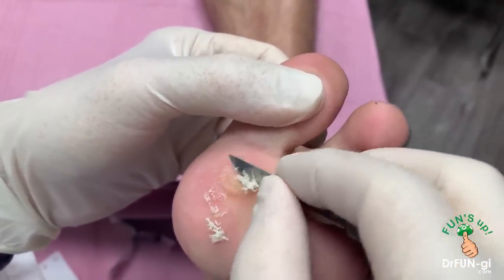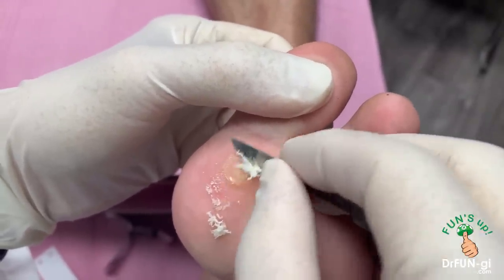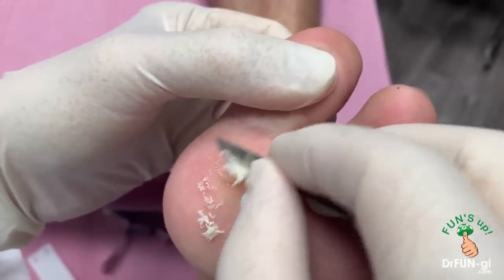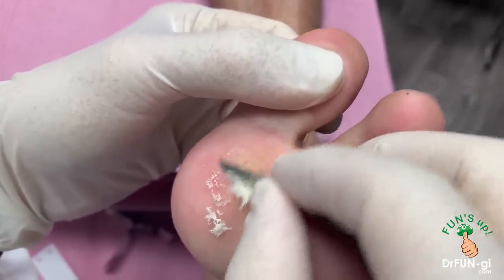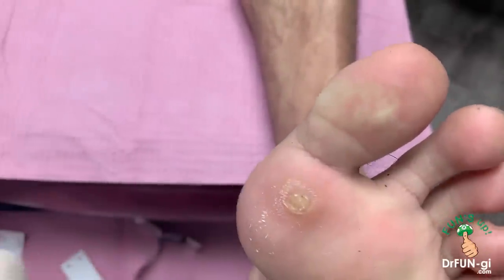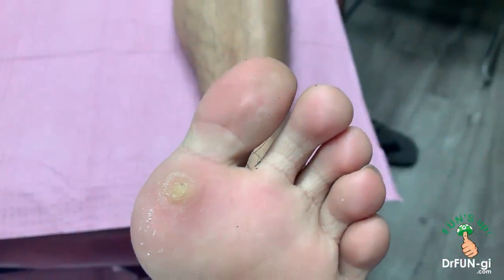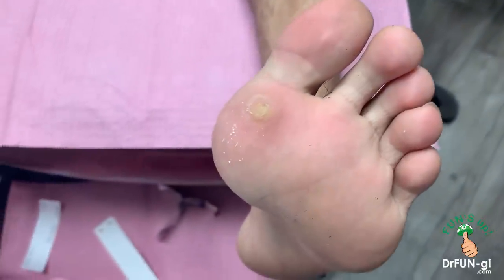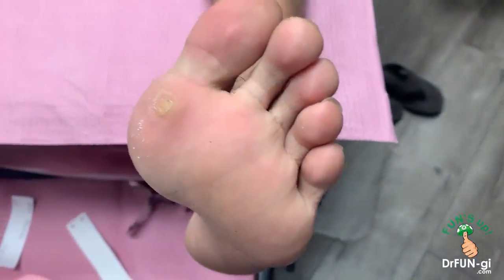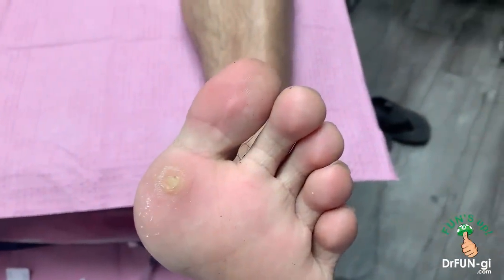So I'm just cleaning it out real good. This is a pretty big size here. It doesn't look that big from the outside, but it's got a deep root and it's very deep inside. And then it starts forming like a callus because it's painful, and then that makes it even more painful. A lot of callus came off. I'm going to use the laser machine over here.